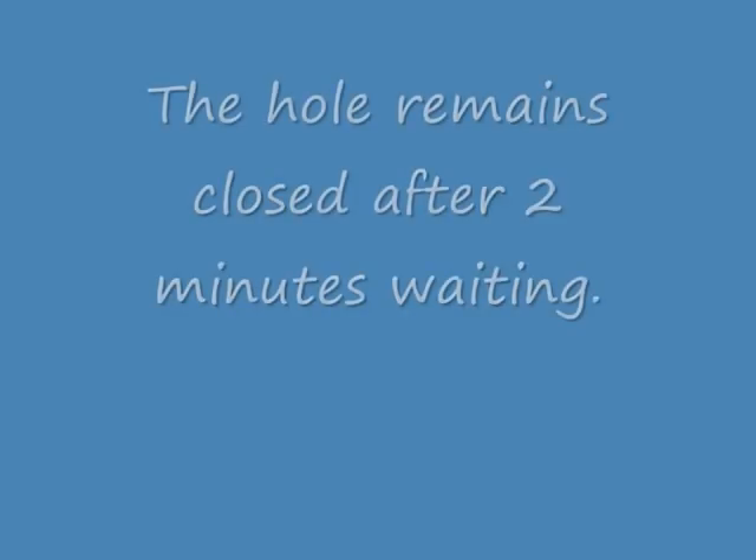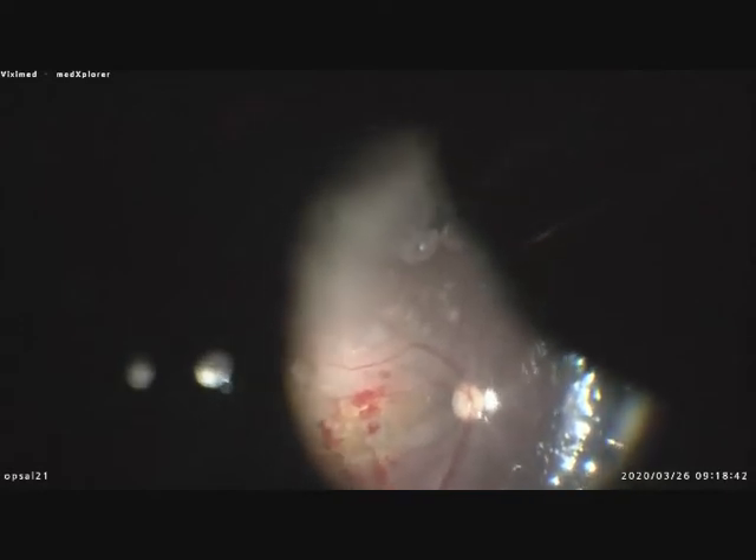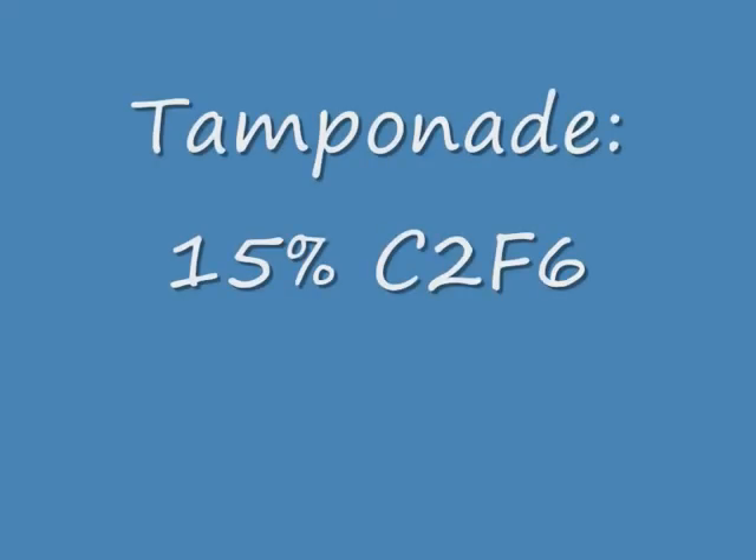You need patience. The surgery takes about 45 minutes because you have to repeat this manoeuvre several times until the hole remains closed — meaning it stays closed after one or two minutes of waiting. This is the final picture; the hole remained closed after two minutes. Then a tamponade of C2F6 at 15% was applied.